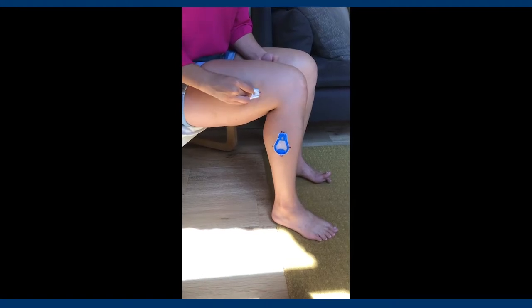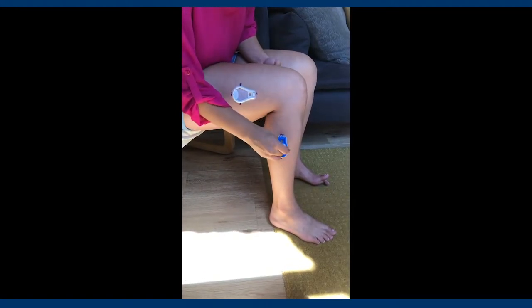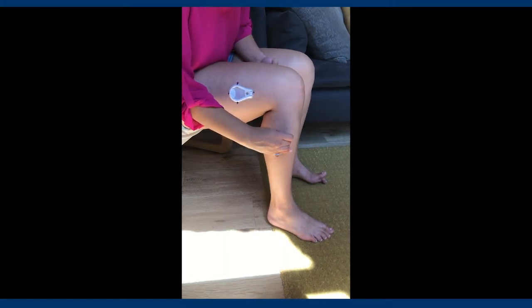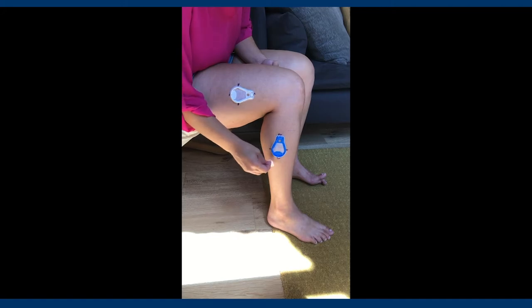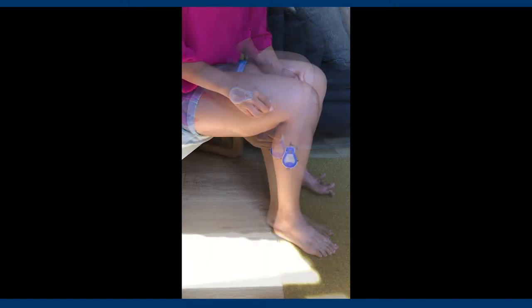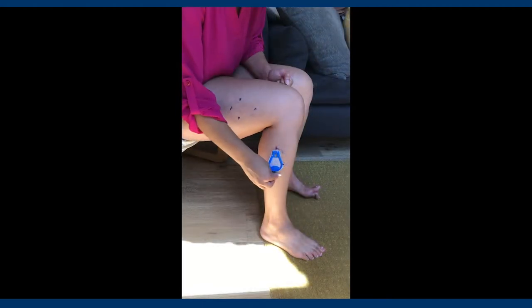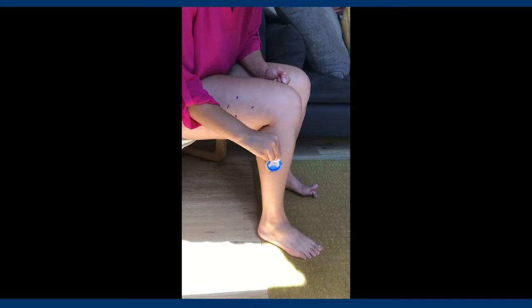Once you mark your skin properly, you will carefully use adhesive remover to remove your old ADP. You should avoid wiping away the marks you just made. You may use more than one adhesive remover pad if your ADP does not come off easily. Always ensure skin integrity is kept while removing your ADP.